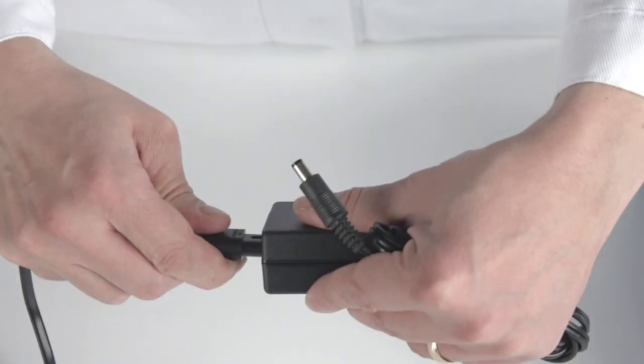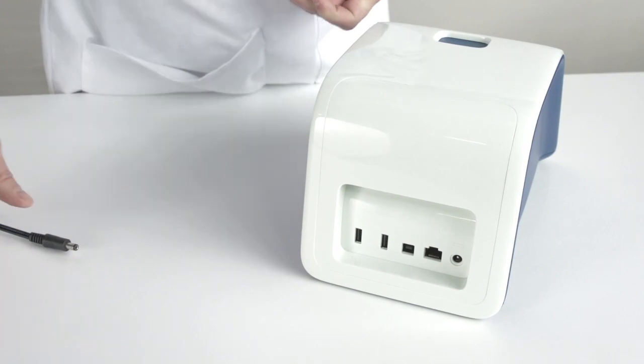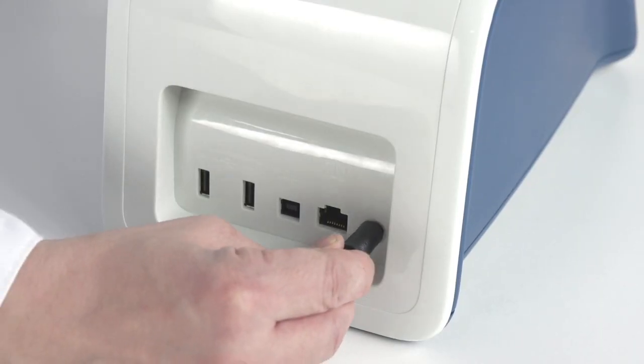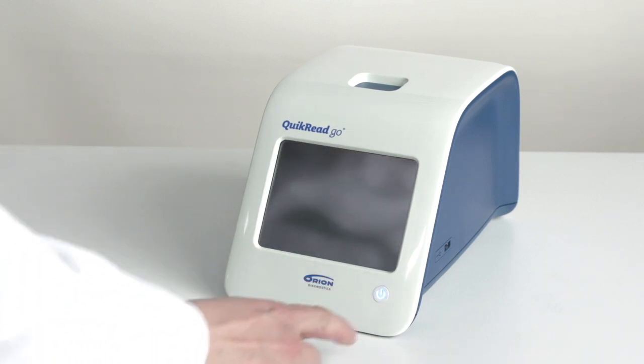Plug the mains cable into the power outlet. Now you are ready to start your Quick Read Go for the first time. Press the power button on the front panel of the instrument.